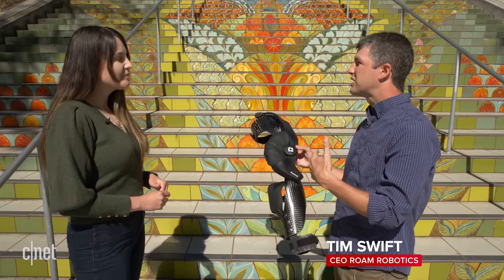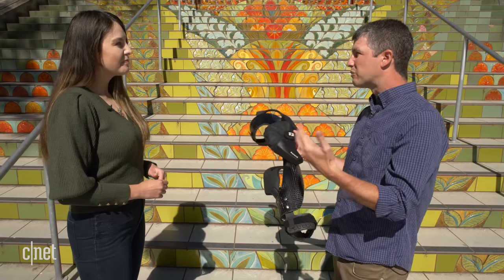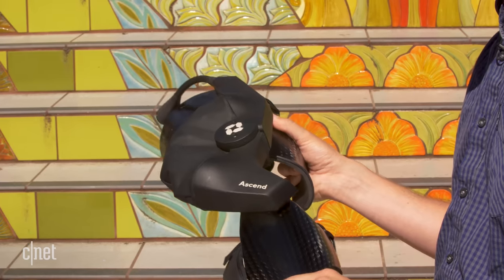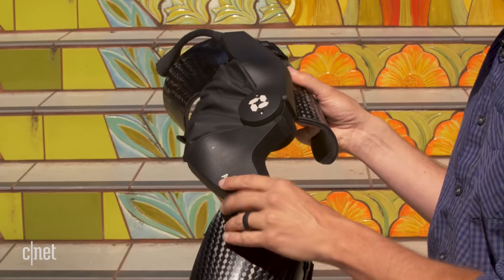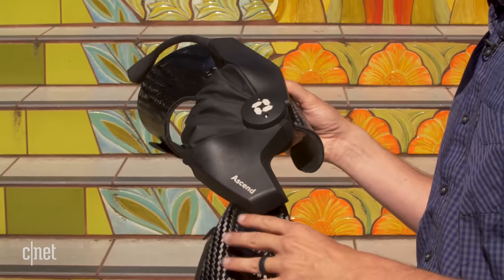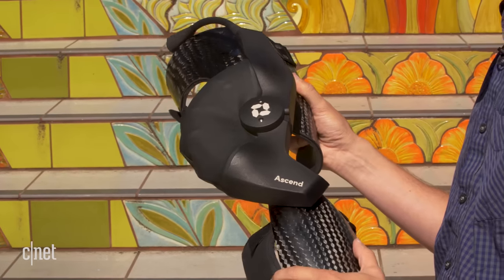When a customer comes in and decides to get Ascend in consultation with their doctor, then they'll be custom fabricated for them. This is really the core of what Ascend is — this actuation unit. There's a novel actuator that lives inside here that uses air and woven fabrics.